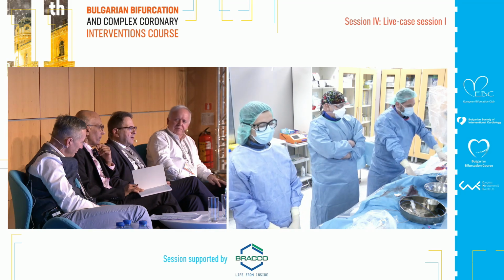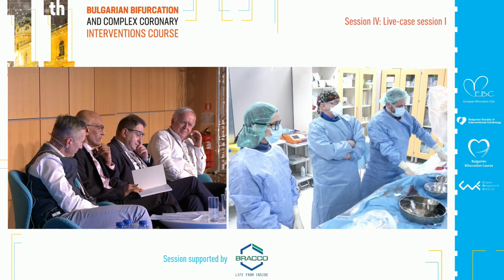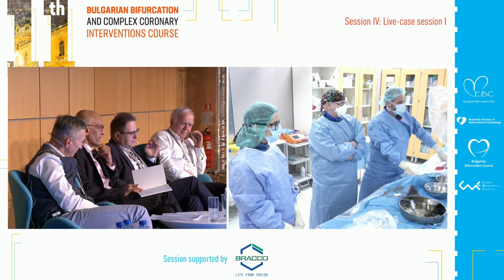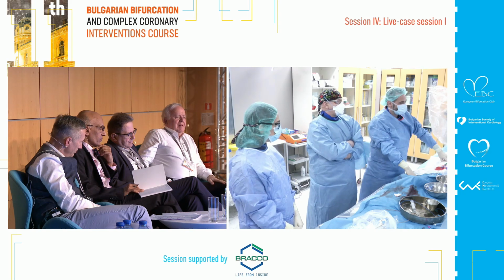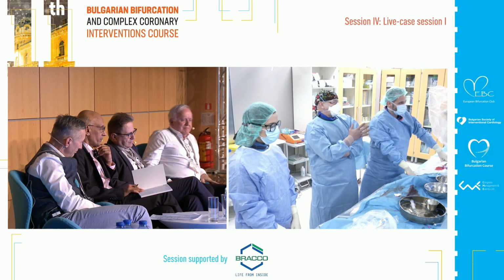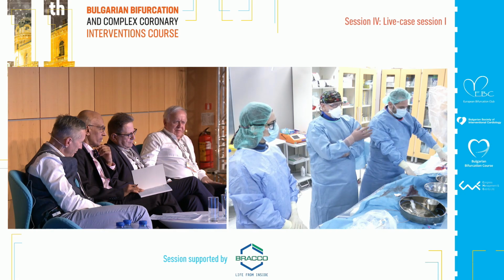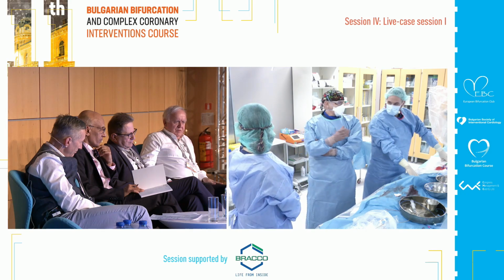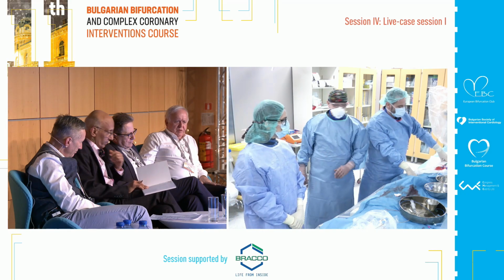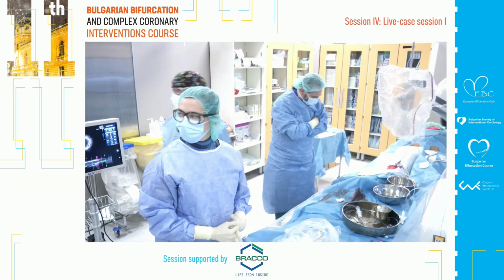Correct. But it will take longer than 8. No, but our compromise is to take something 12 or 15 to stay on the safe side. Otherwise, it's going to be quite difficult. The idea was whether we are going to put the stent to overlap the previous stent, but Kiko assures us that there is no disease and that's not necessary. So we are going to take a shorter stent, not overlapping, but not extremely short.